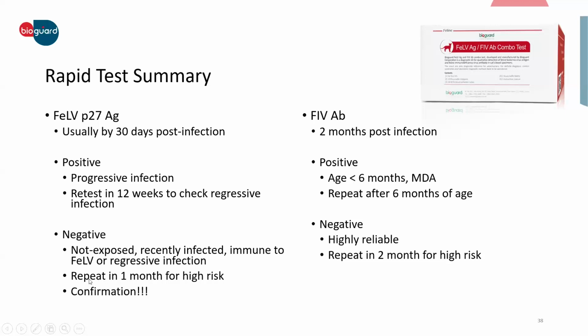So for a high-risk cat, it is suggested to repeat in 1 month, especially for recently infected cats. And of course, it may be the confirmation of FeLV negative.